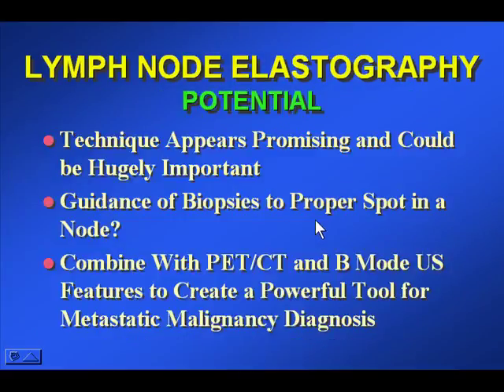So the potential for lymph node elastography is quite great. It's a common technique to biopsy lymph nodes, and knowing which ones to biopsy would be very useful. It possibly can be combined with PET-CT and regular B-mode ultrasound to create a powerful comprehensive tool for metastatic malignancy diagnosis.